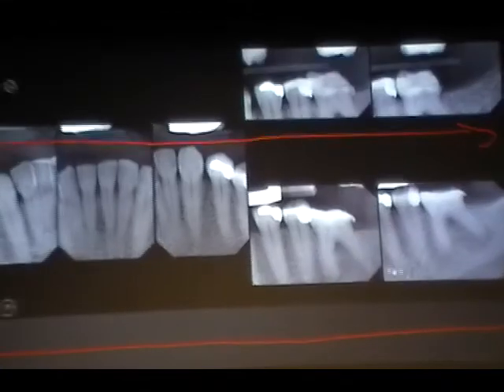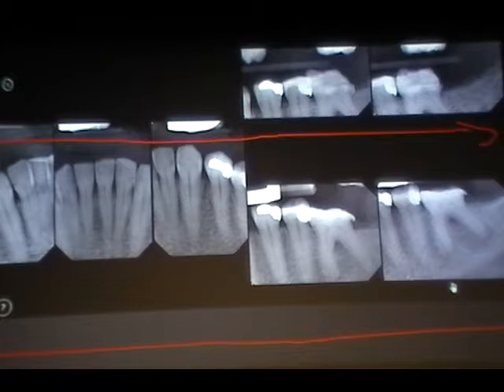How about this one? Is it a good radiograph? In that view, you are supposed to capture what are the things? Molar view. First molar, second molar, third molar, right? In this case, the second and third molar, it looks like they are missing. Right? Because I don't see any tooth here. I would imagine, for that particular instance, yes, this is a pretty good view because you can see 2 millimeters beyond the apex. You can see there's something in pathology.